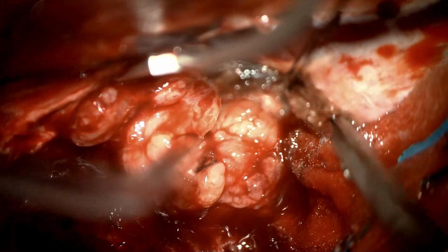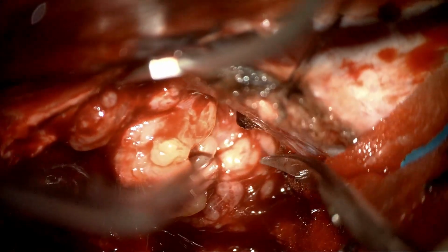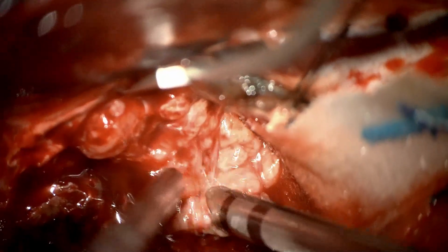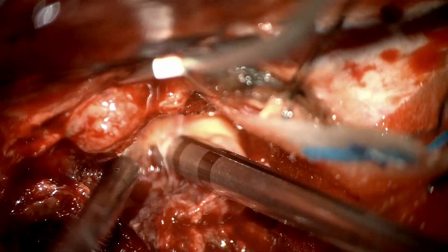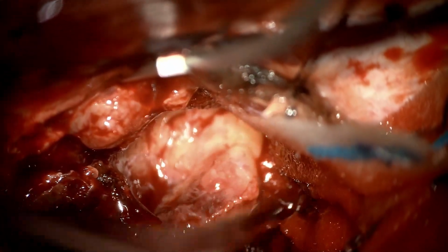At the same time, the falx is acting as countertraction, so I'm able to bring the tumor capsule into the cavity I create. Here you see how I proceed with further debulking to allow further tumor rolling.